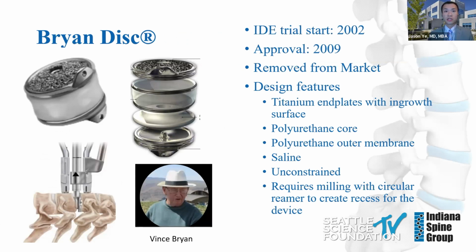My mentor, Dr. Rick Sasso, performed the first Bryan disc in the United States. The Bryan had a porous titanium surface for ingrowth, which obviated the need for a large anterior flange and screw fixation. This reduced the anterior profile and may have improved dysphagia. The articulation was polyurethane on titanium.